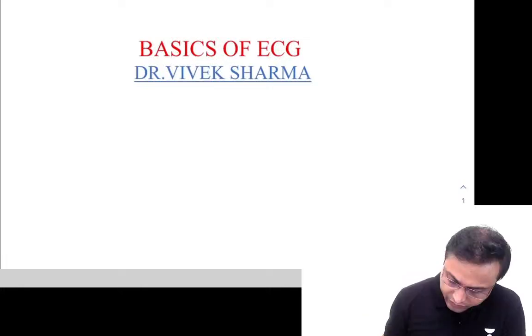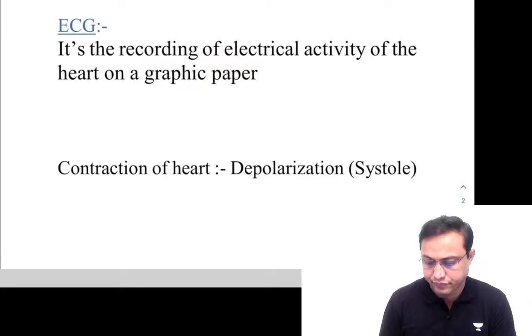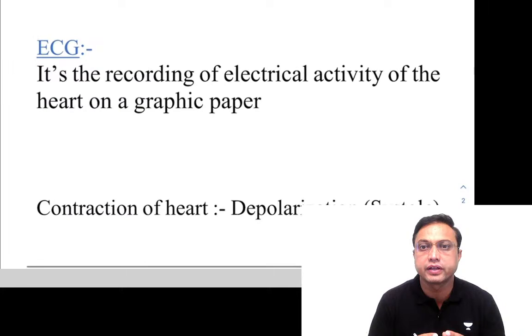So let's start with a very basic thing. What is this ECG? Now ECG is basically, as it is written on your screen, the recording of the electrical activity of the heart on a graphic paper, or in other words, the graphic representation of the electrical activity of the heart.